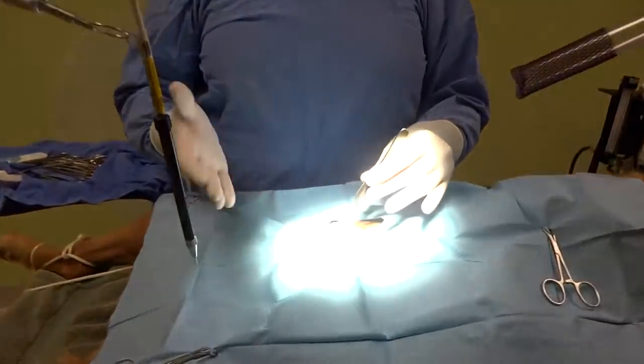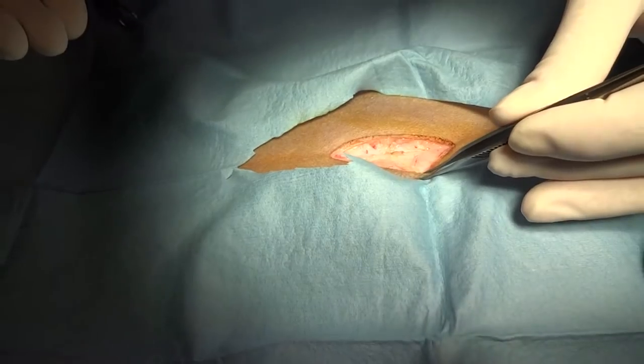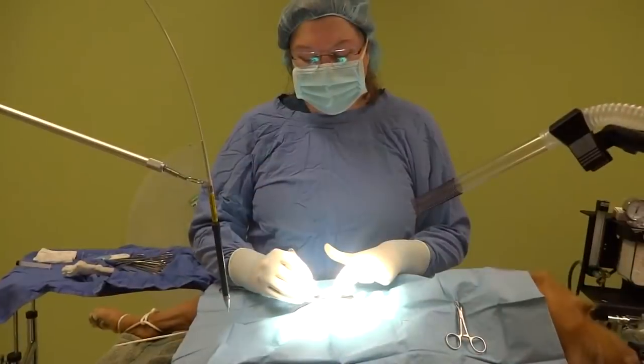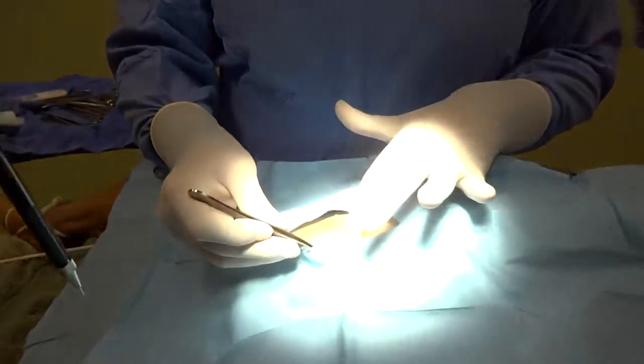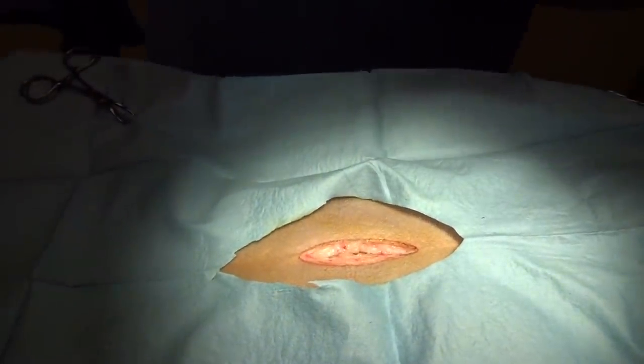We've made our skin incision with the laser and as you can see there is no bleeding. There's still no bleeding due to using the surgical laser. So we'll now proceed with the spay.